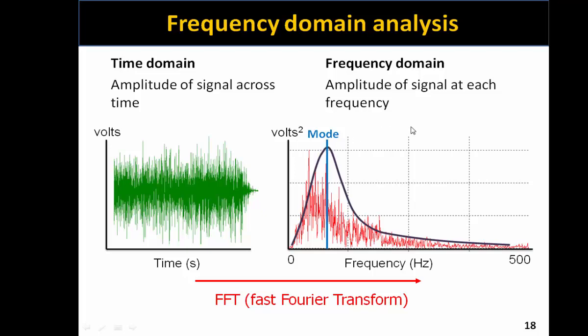It's very rarely used in frequency domain EMG analysis. The most common and most valid approach is what's called the median frequency. The median is also referred to as the center frequency, and it's defined as the frequency along the x-axis that divides the entire area under this curve in half, and it's the most commonly used one.